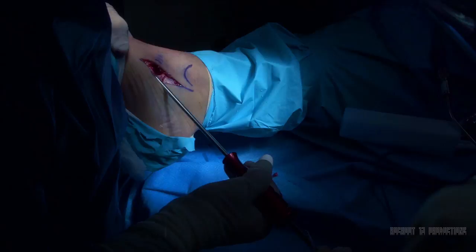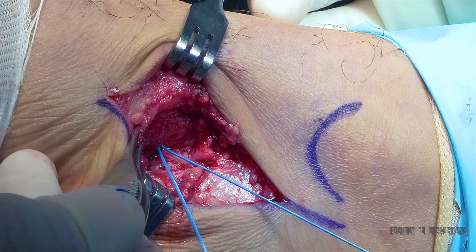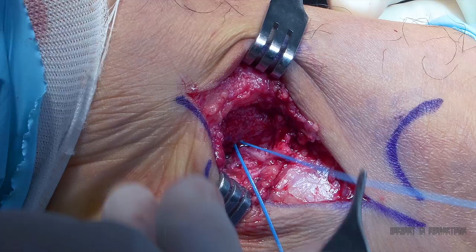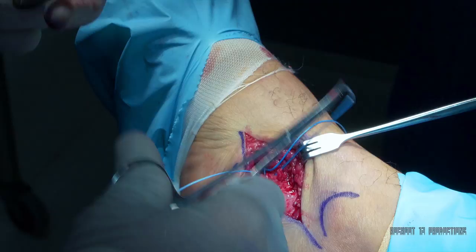Suture anchors are often used at this point for reattachment of the posterior tibial tendon or to reinforce the repair. In this case, two Stryker Iconix suture anchors were used for tenodesis and repair purposes. The first anchor is inserted posteriorly on the navicular and the second anchor plantar medial on the navicular for two points of attachment. A free needle is used to pass the fiber suture through the posterior tibial tendon, which is tied down firmly on the navicular to allow for tenodesis.